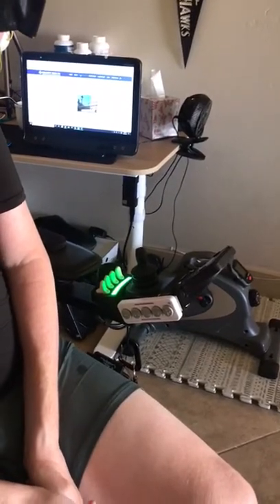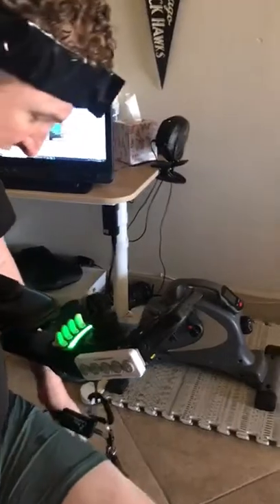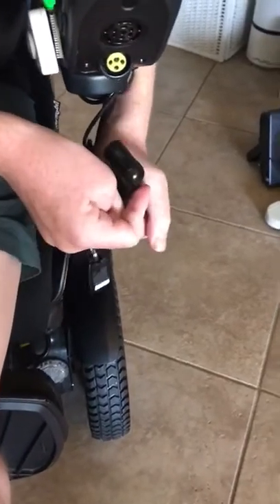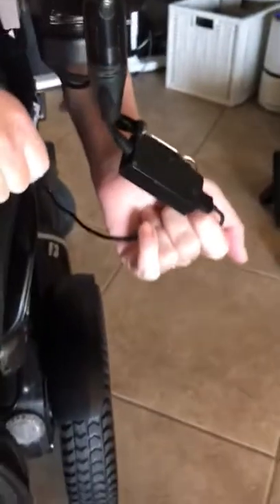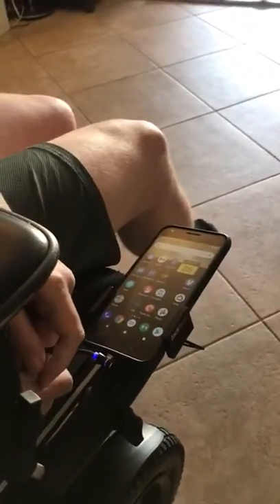This is a charger for my phone. It connects into the wheelchair and charges the phone. It's got a little USB cable connected to it and it goes all the way around to the other side and connects to my phone. The blue light means that it's connected.